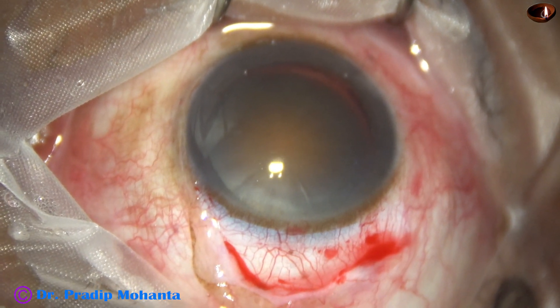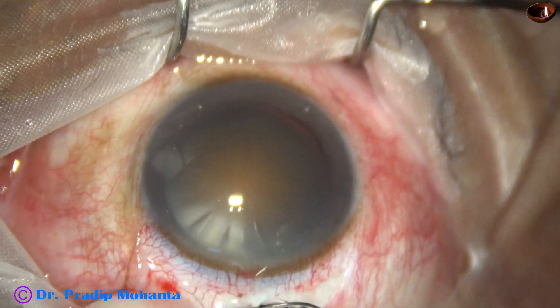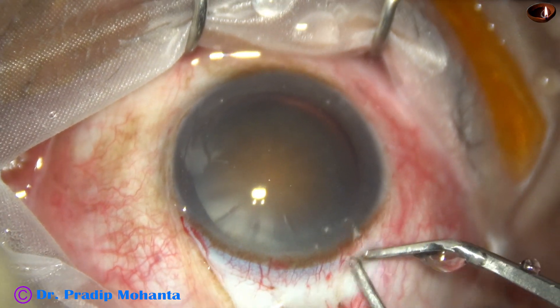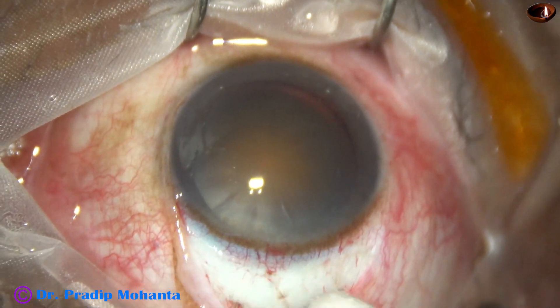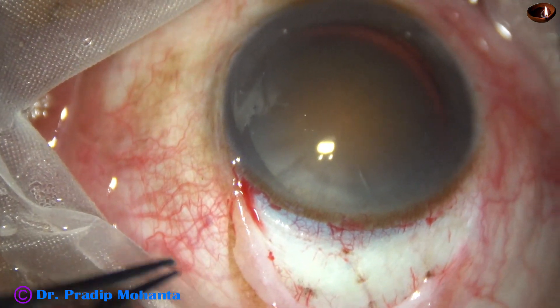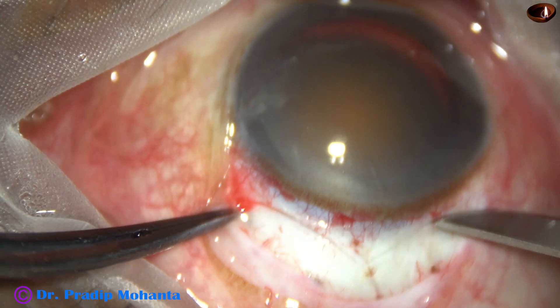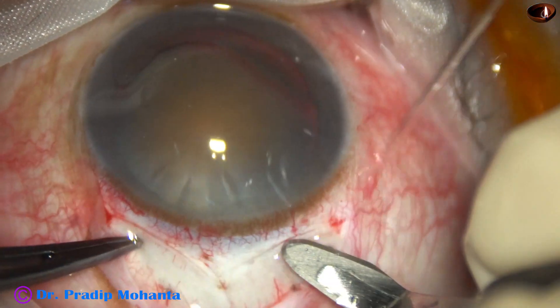So my plan is to do extracapsular cataract extraction, manual technique. In this case, my plan is what I call double SICS — two SICS wounds adjacent to each other — and only one suture is needed at the apex of the two SICS wounds, at the junction of the two SICS wounds. This is one SICS wound and this is the other one. It is 5 plus 5, a 10 millimeter wound.